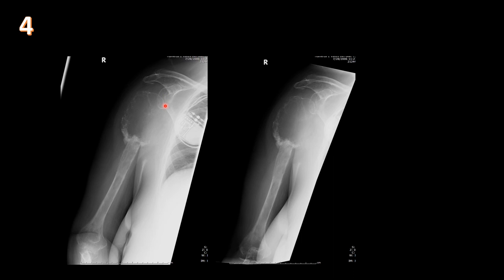Fourth case: AP and lateral views of the right humerus show a large destructive lucent lesion within the proximal humerus with a wide zone of transition at the mid-humeral diaphysis, cortical breakthrough, and extension into the soft tissues. In an adult, every aggressive lytic lesion requires two main differential diagnoses: myeloma versus lytic metastasis. This was the only lesion in this patient, so it was a plasmacytoma.